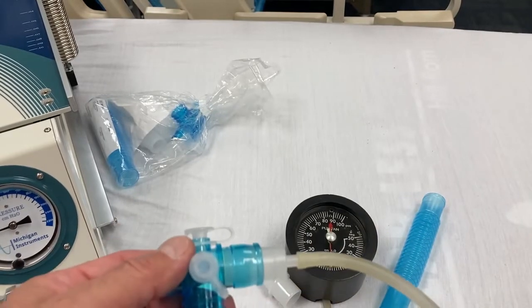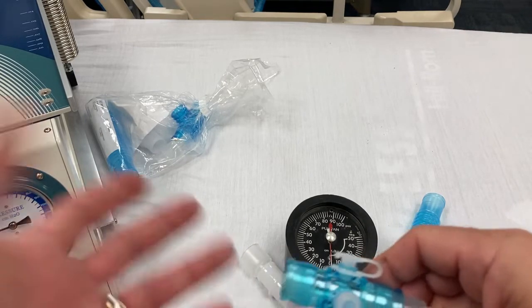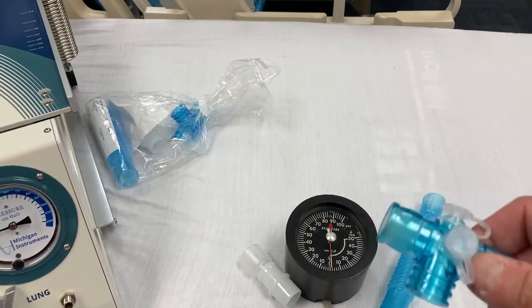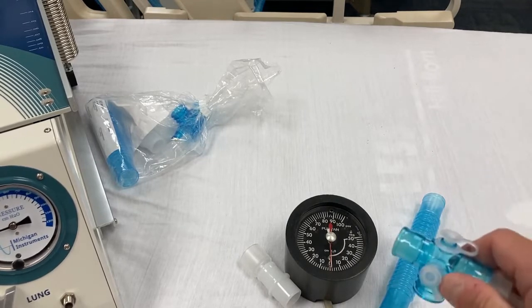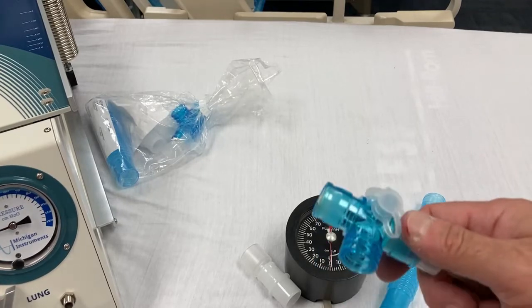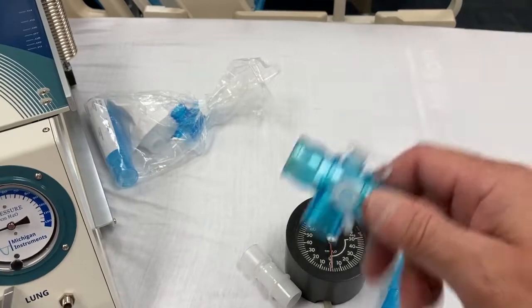So I like to tell them that. I say, okay, I'm going to do a last test here, and I'm going to take you off the ventilator. It's going to feel pretty much like it does right now, and I'm going to see how strong you are. I'm going to see how hard you can pull. I say, so when I tell you, I need you to pull as hard as you can, and you won't be able to get any air in. I think that's really important to tell people, is they won't be able to get any air in, but it's only for a few seconds.